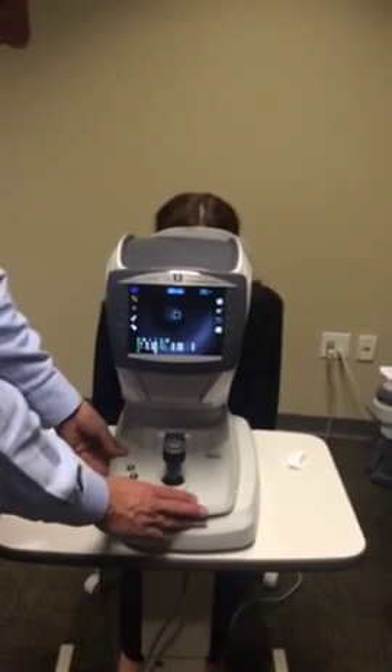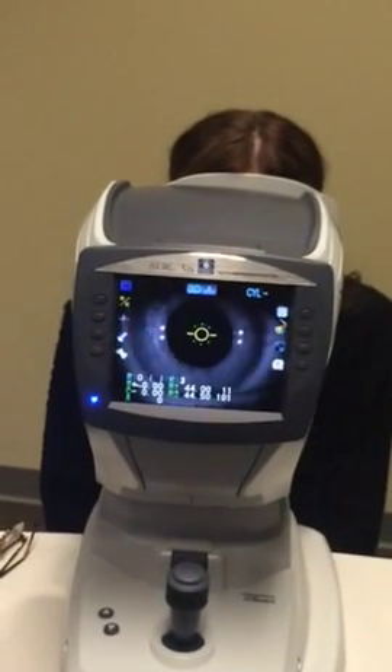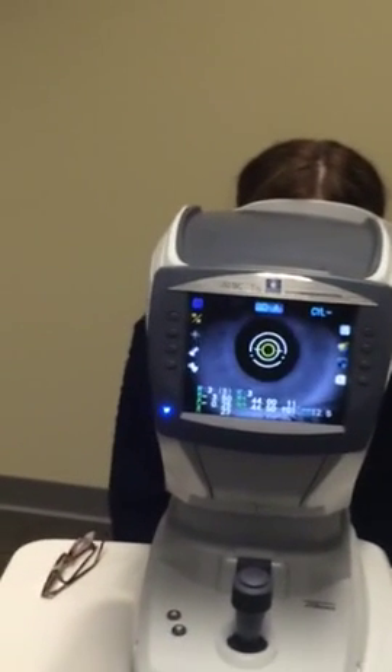I'm going to find the patient's eye, slowly bring it in, and then let the tracking take over. Those first three beeps are the K readings, and now it's taking the autorefractor readings.